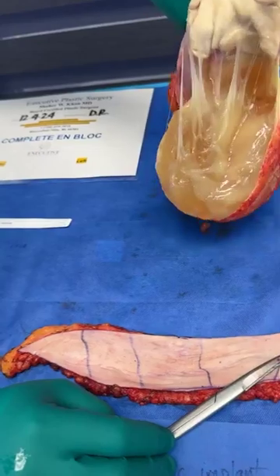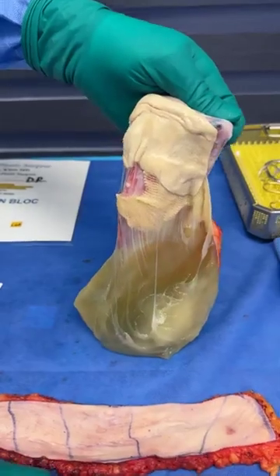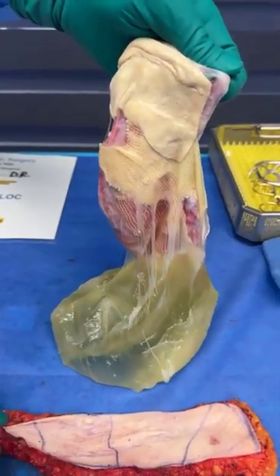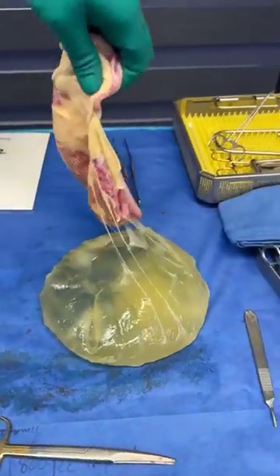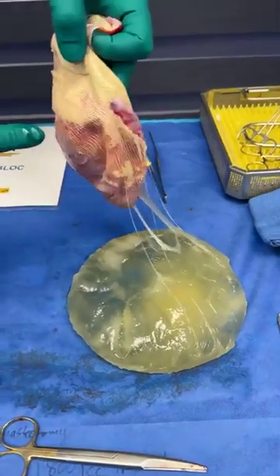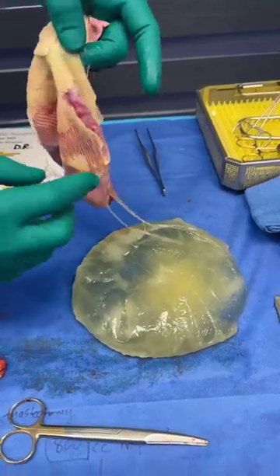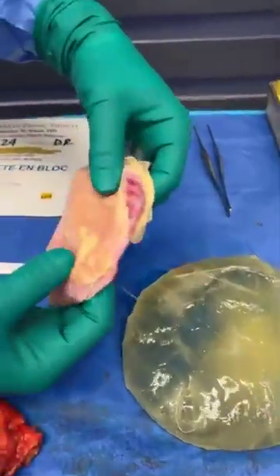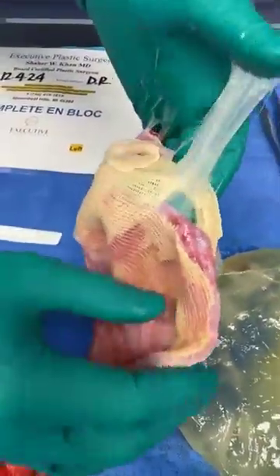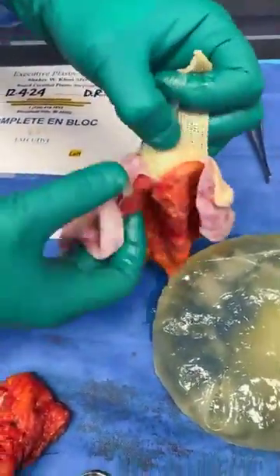And as I let go, you will see this huge, the largest implant that they make. This is, you bet, the safer, better, nicer gummy bear, right? And look at all what was used in the reconstruction. You can see the mesh. And you can see the hurt that the patient was going through. Look at this. And I can literally tear it out.